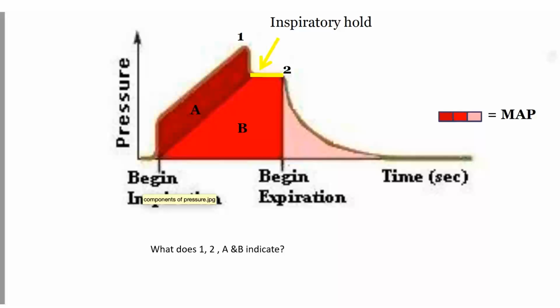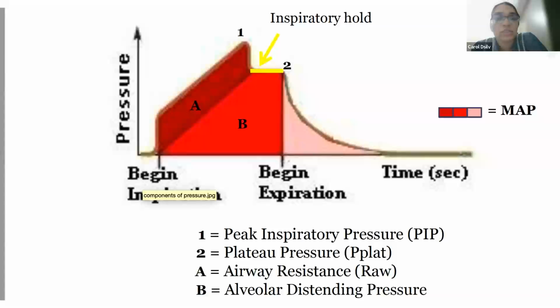To differentiate the cause for the rise in pressure. Just, I'll come to this in the next slide. We'll discuss this a little bit more in detail. So you all were right. The peak inspiratory pressure is the maximum pressure. The plateau pressures.